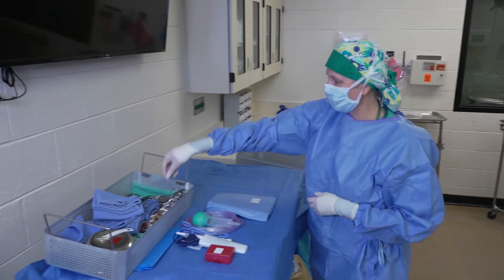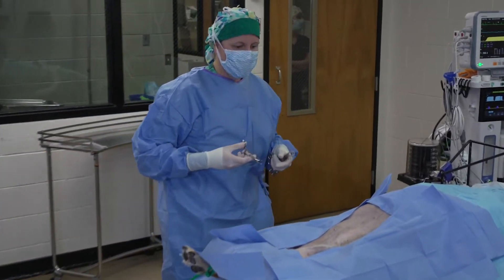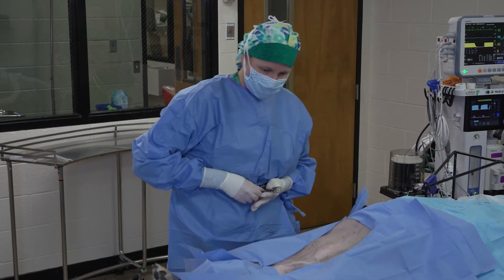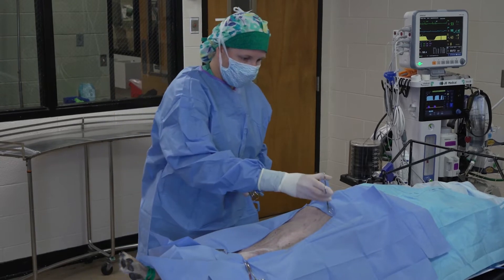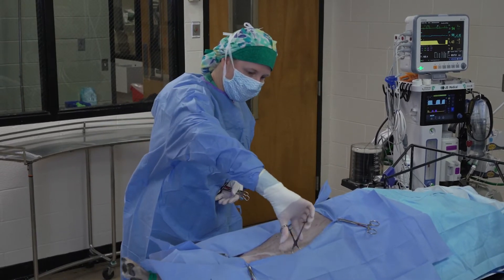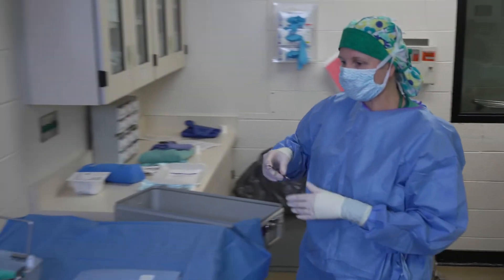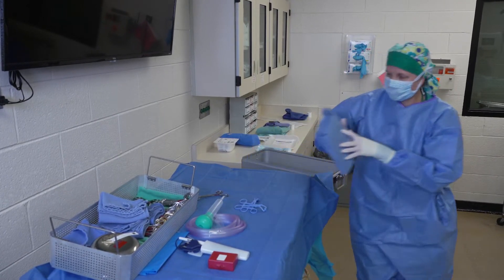Now I can place my towel clamps to hold those drapes in place. Even though the drapes have the adhesive strip, those strips don't tend to work very well, so I'm going to clip right at the corners of the drape, clipping both drapes and a little pinch of skin. Again leaning away as I clamp the far side. Since this is a long incision, I will clamp kind of midway down as well to prevent that drape from pulling back too much — careful not to go into that dog's splenic mass with that one.